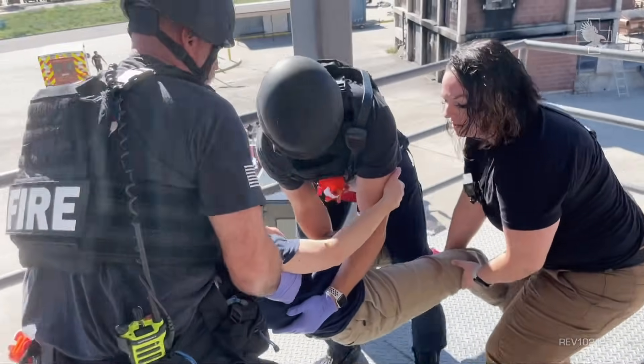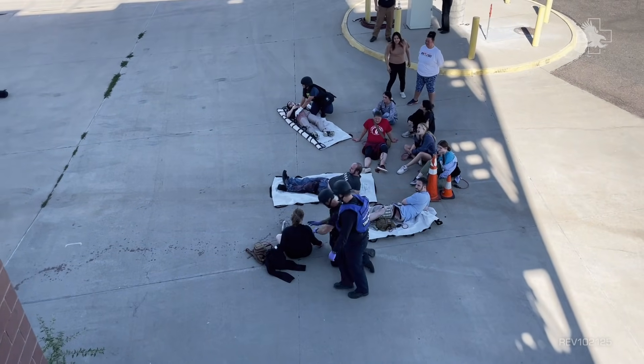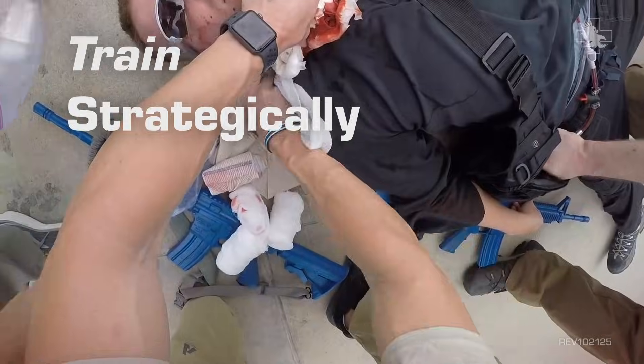Enhance your training with a system that allows you to be creative, student-focused, and outcome-based. Train often, train effectively, and train strategically with SMRT.